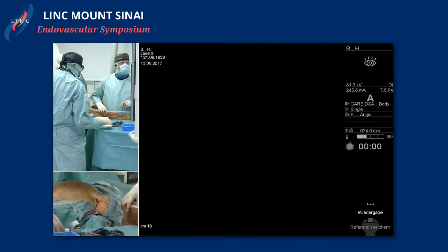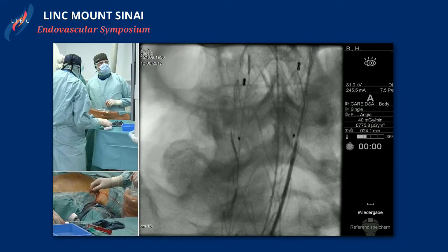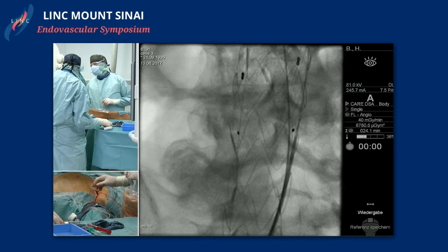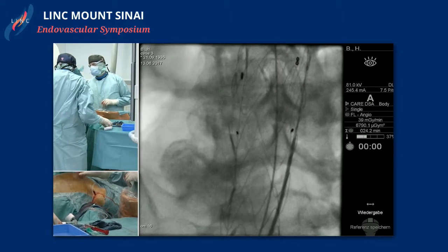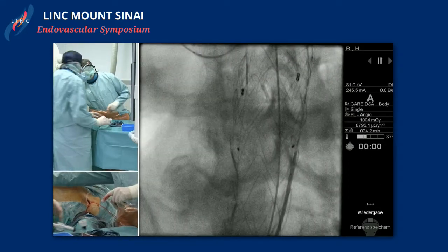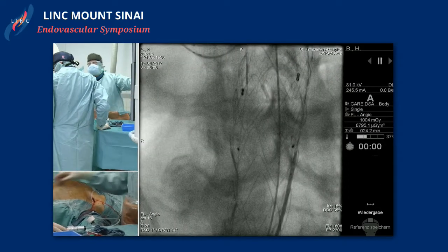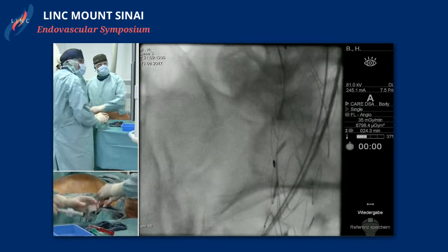I think that's a very good discussion of the different options as you go through this, because obviously you have to think about all these things. They're saying, do I want to do a fenestrated with scallop? If you can have a scallop, you can actually enter back in and go through the fenestration from above. And that would be one other way of doing it. But I think the size and everything else certainly makes this probably the best way of going.